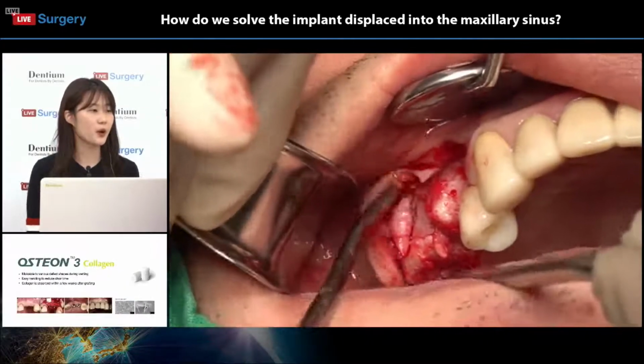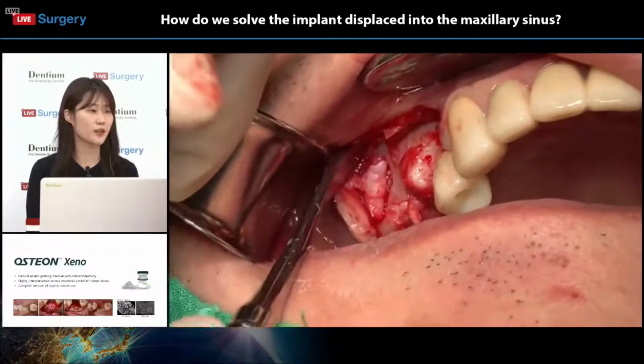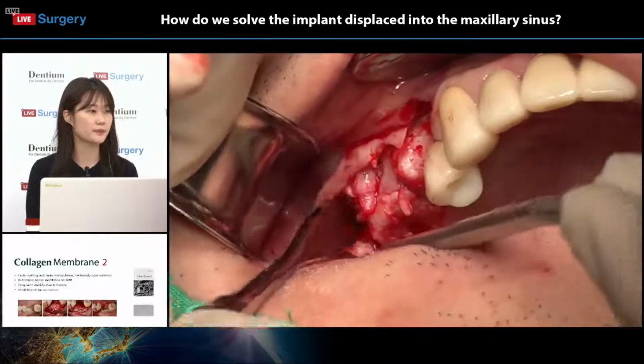As mentioned before, the collagen membrane previously used to cover the sinus is being removed.